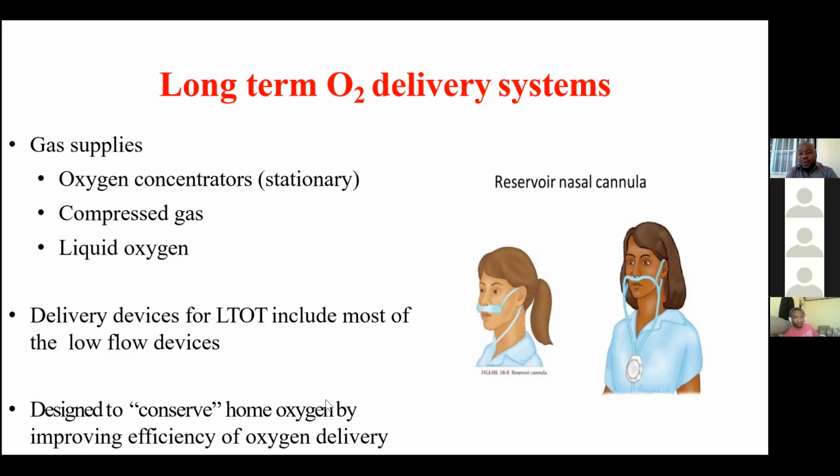So from the procurement plan, please think about all the things we are talking about, so that we hope we will be managing our patients by non-invasive measures, and we give them the oxygen they need to correct the hypoxemia as we are discussing at this time. Next, please.